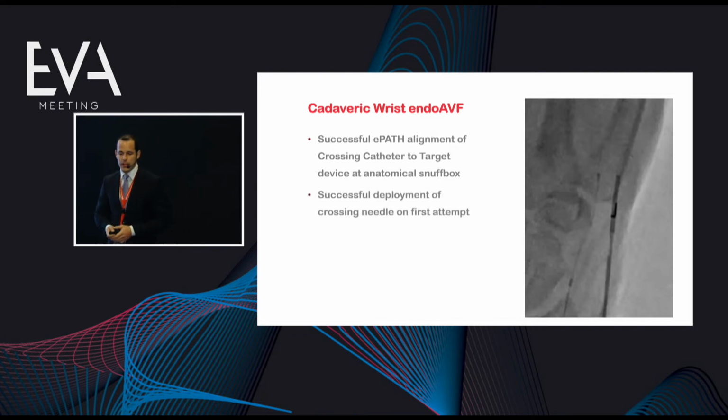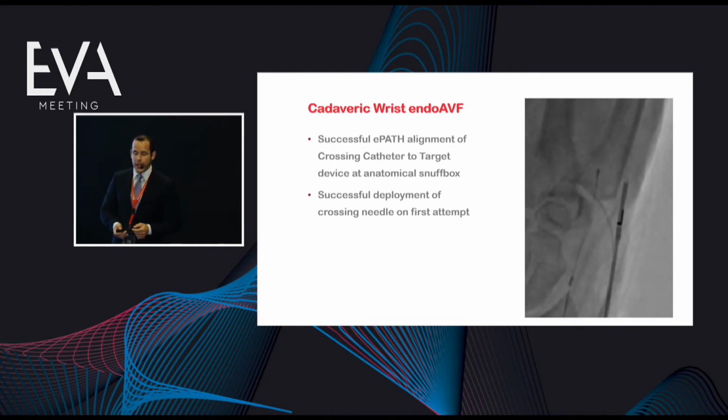It takes like 30 seconds. Successful deployment of the needle, the first attempt. You can see here the needle coming out, 1, 2, 3, out. It goes through from the vein into the artery.